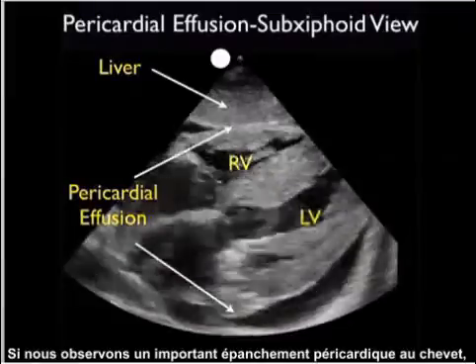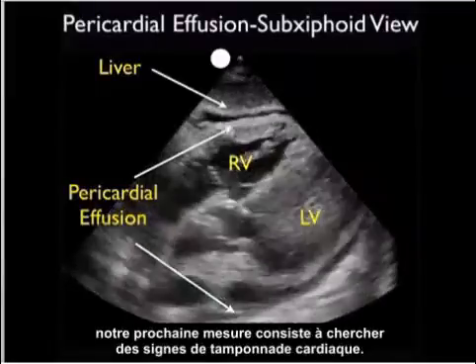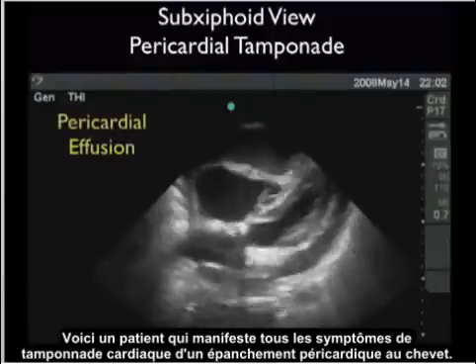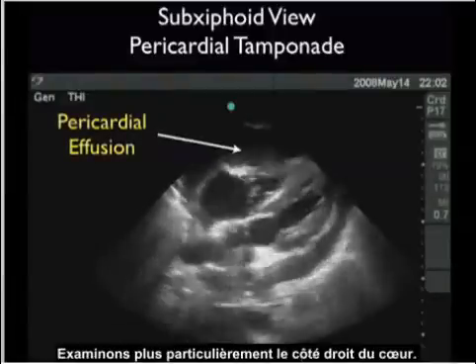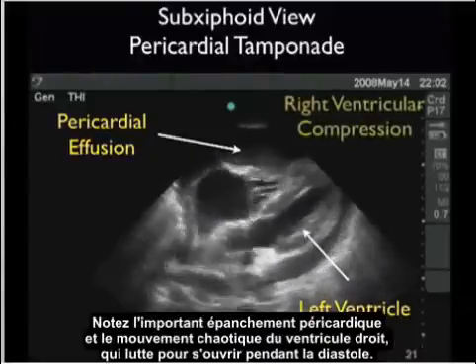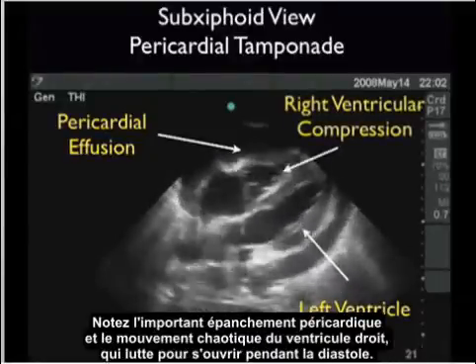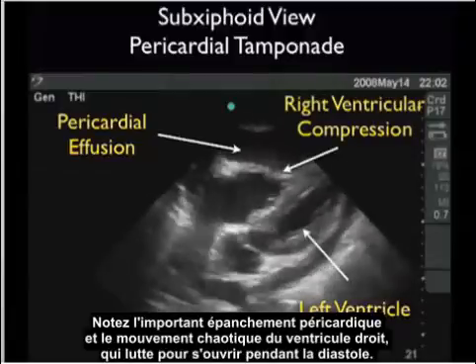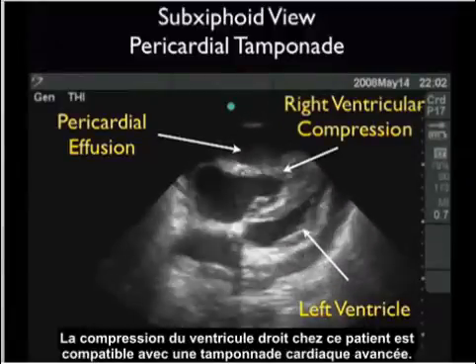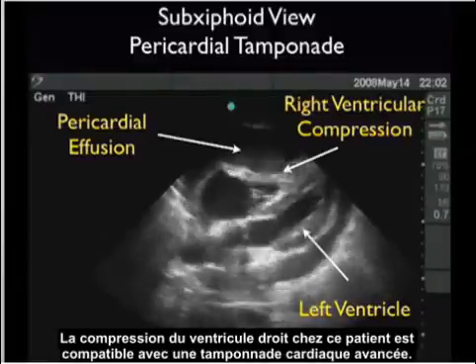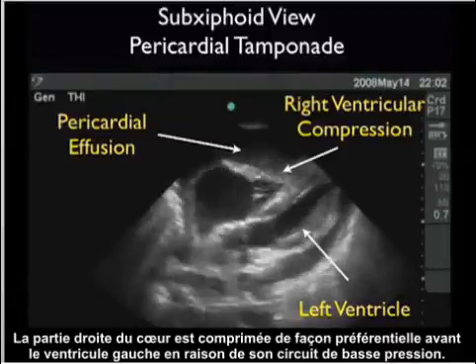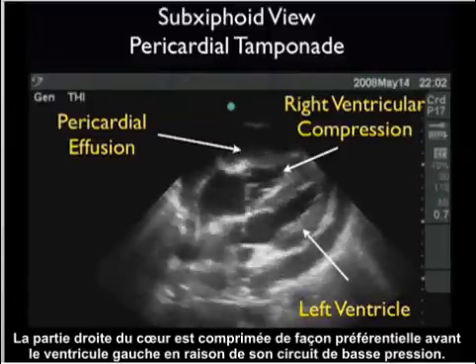If we see a large pericardial effusion on bedside echo, our next move is to look for signs of cardiac tamponade. Here's a patient who manifests all the signs of cardiac tamponade on bedside echo. Let's look specifically at the right side of the heart. Notice the very large pericardial effusion and note the chaotic movement of the right ventricle as it struggles to open during diastole. The compression of the right ventricle in this patient is consistent with advanced cardiac tamponade. The right side of the heart is preferentially compressed before the left ventricle due to its lower pressure circuit.